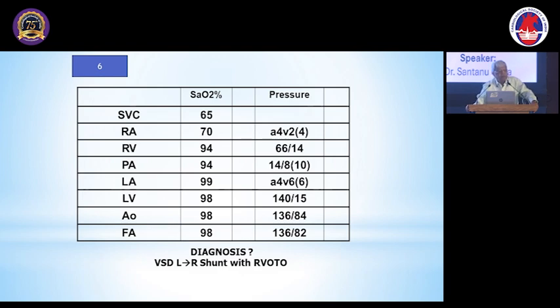That is also an indicator of whether there is an MR. If you develop an MR, the V wave would have been more. I was just going to say that, but here there is no MR because the V wave was 40 pre and it is 22 post. So there is no MR.